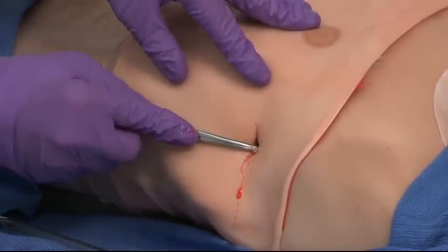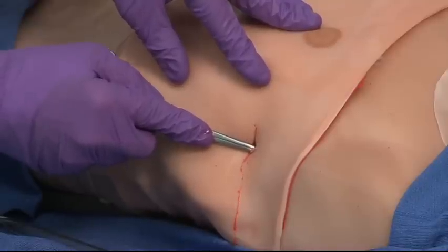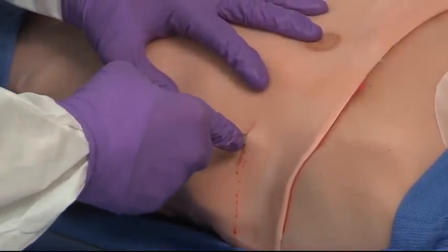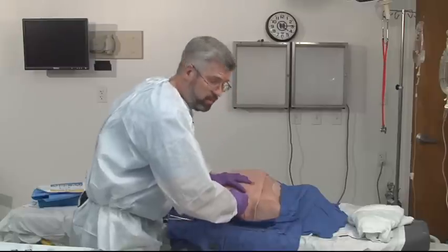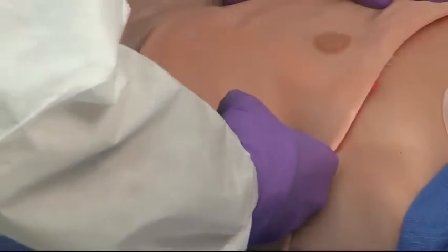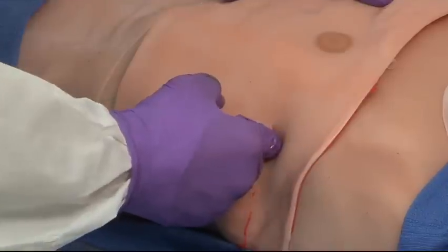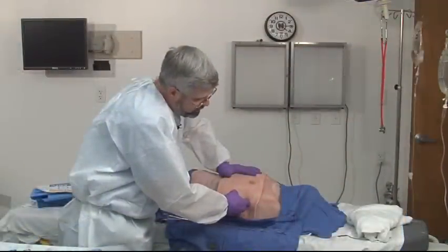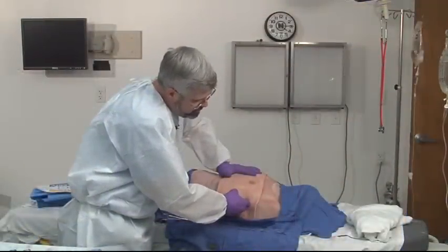You're going to go directly over the rib that you put your finger on a moment ago, and you're going to push up and over the rib and into the chest. And this maneuver requires a substantial amount of force if done properly. And you generally will feel a large pop. The thing here is in a young, healthy, muscular patient, this can require quite a bit of effort, and so don't feel nervous about pushing too hard.